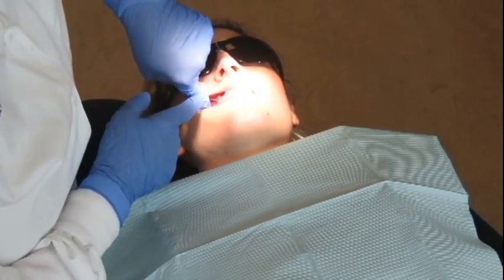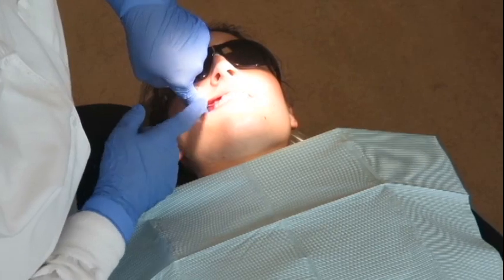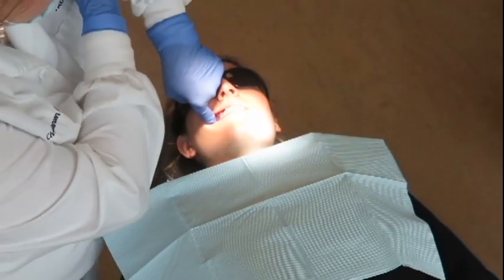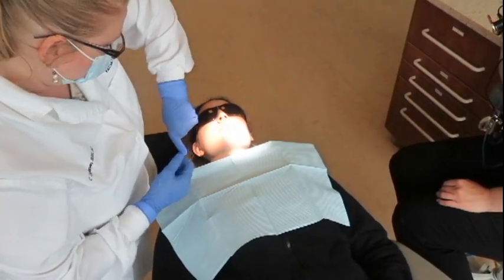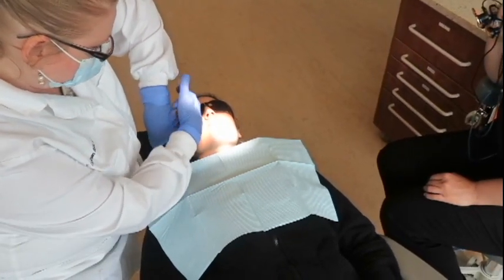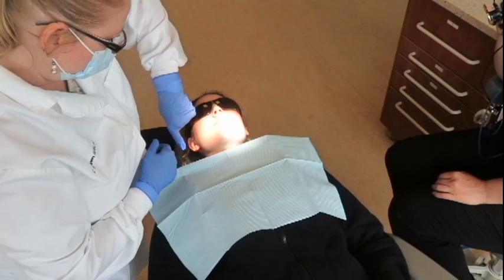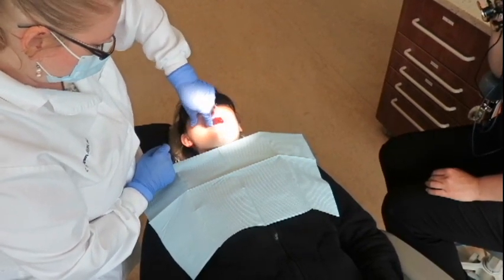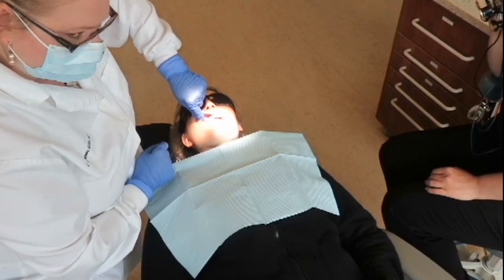I want to talk about retraction. When you're retracting for the PSA, notice my arm — my elbow is up. My hand is twisted so that the palm of my hand is towards the top of my patient's head, and my finger is straight. You don't want to grab the lip like you would for the MSA, because that's not going to work.